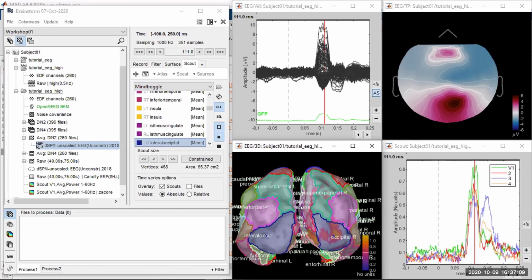And actually, let me just end by giving you an example of a connectivity result, and then maybe we can open the floor to more specific questions. I just want to make sure we don't run out of time here.